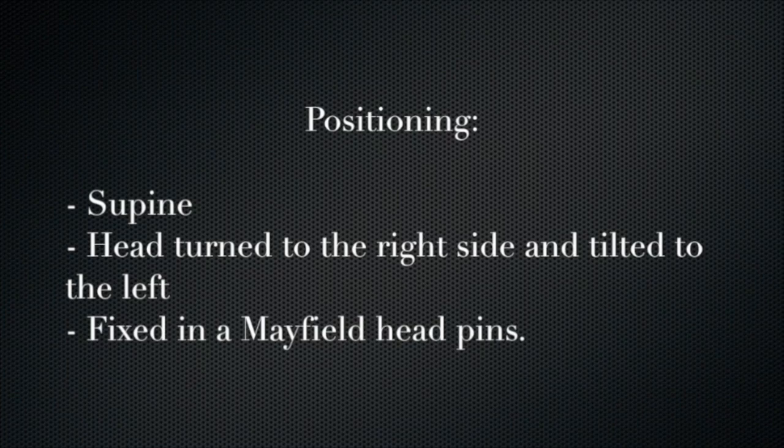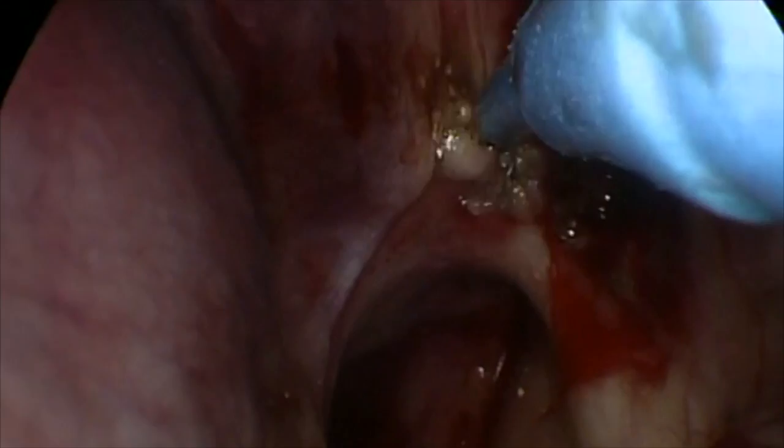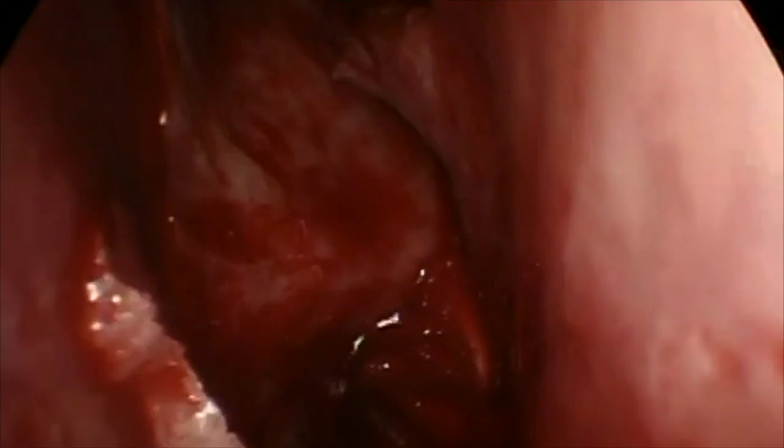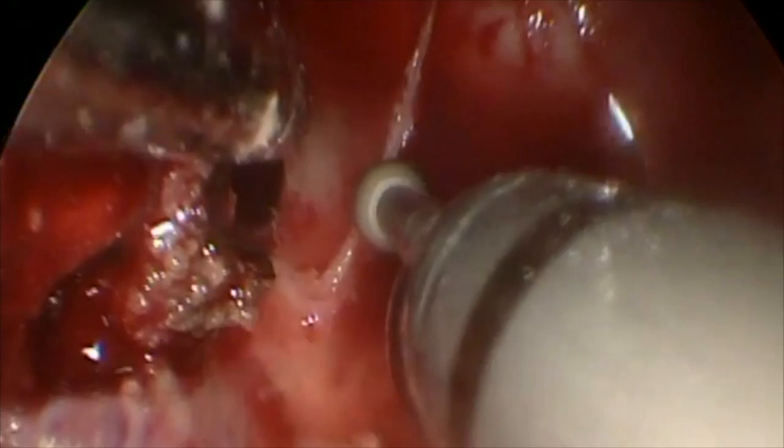The middle and superior turbinates were resected bilaterally. A nasal septal flap was made in the left nostril and positioned in the nasopharynx. A reverse flap was made on the right side. After extensive opening of the sphenoid sinus, we drilled the septations to expose the middle clivus between the paraclival carotid arteries below the sella.